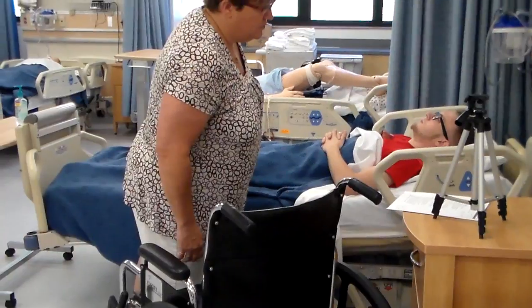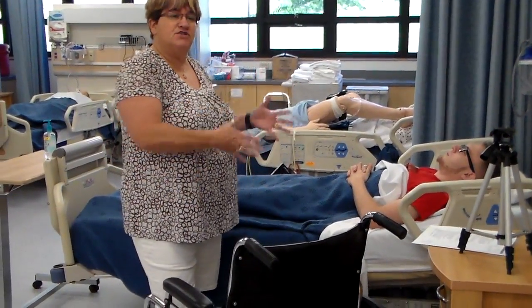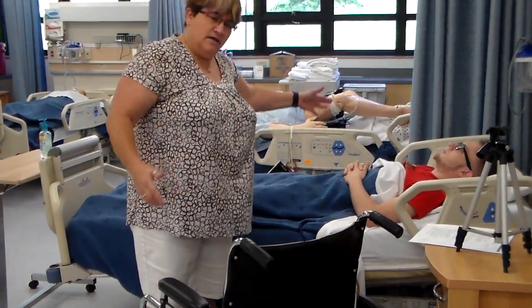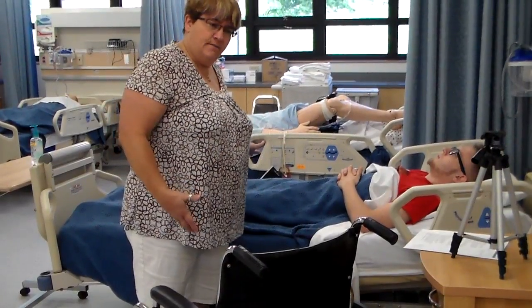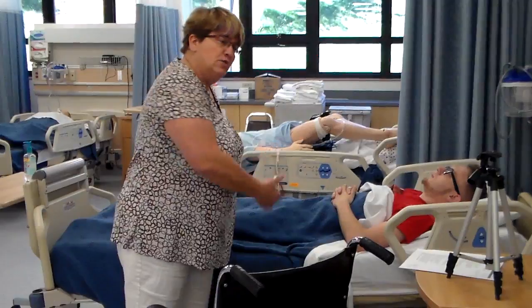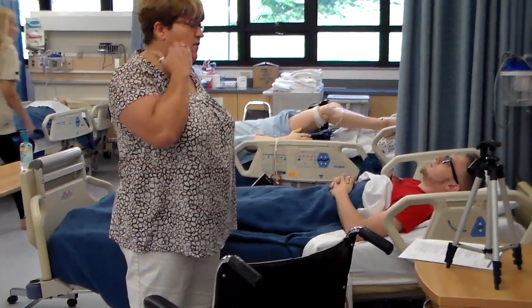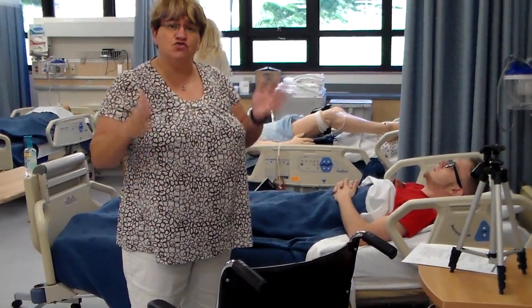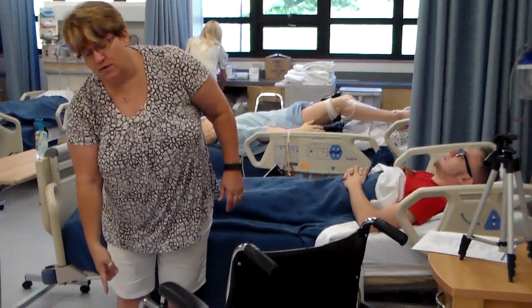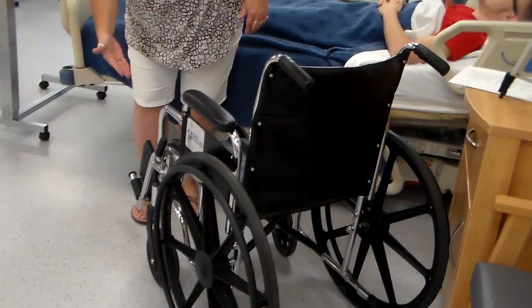And then we're going to also put it on the side of the bed that is to the patient's strong side, meaning if this patient had a leg that didn't support him as well, you wouldn't want to be moving him towards that leg. You would want to be moving him towards the leg that could hold him, okay? So we're going to position it on the strong side. The only other thing is that we want to remove or get these legs of the wheelchair out of the way.